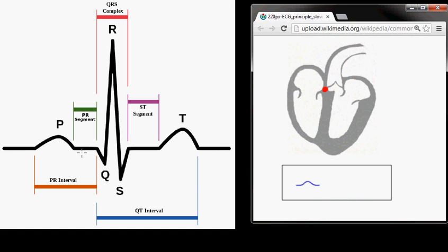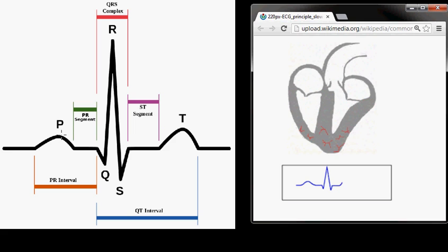Now on the left here, each one of these waves have been labeled. The first labeled wave is a P wave, which is the atrial depolarization and atrial contraction.